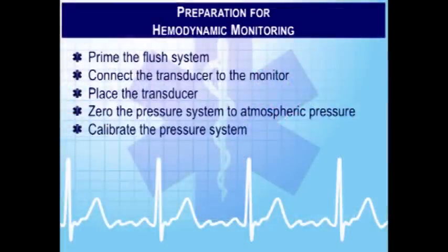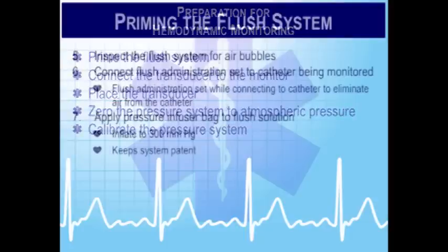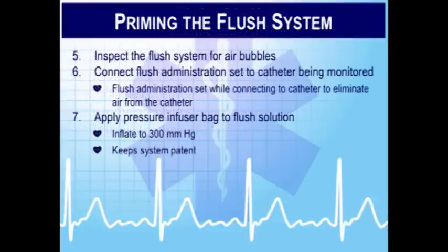The key thing with the transducer system, I'm not going to belabor this too much, is that you learn very quickly that if there's a little air bubble in the IV tubing, it ain't going to hurt anybody, right? It takes a significant amount of air intravenous before it's actually harmful to most patients. When we have a transducer system, I don't want any air bubbles between the catheter that's coming out of the patient's body and that transducer, because that little tiny air bubble is going to affect the integrity of how that waveform is displayed or transmitted back to that little diaphragm in the transducer, okay?